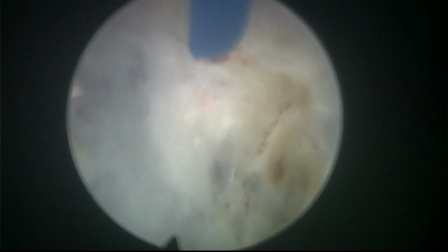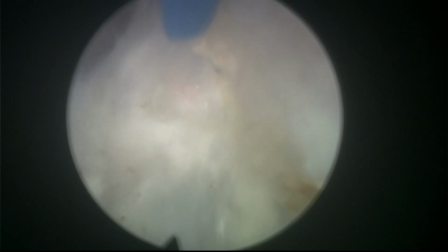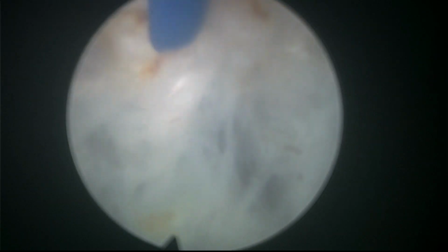And to me, it's more relevant to be able to target your laser very precisely, either against the line of attack or a little bit inside. That's a small nodule, as you can see here or there. You always have to, I guess you don't want to fire there. You want to fire a little bit more against the adenoma to see if we can cut these attachments without letting the energy go deeper.